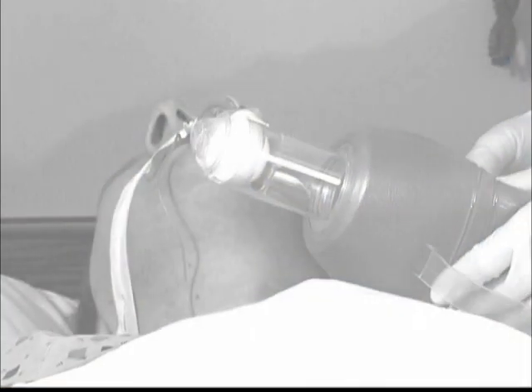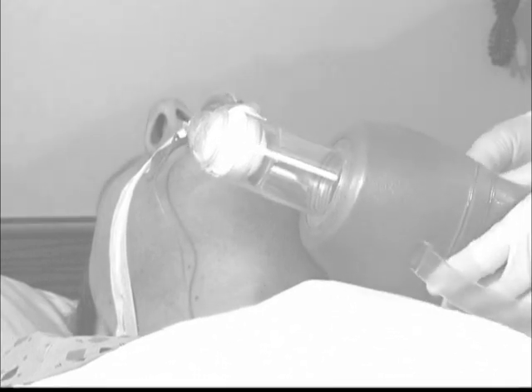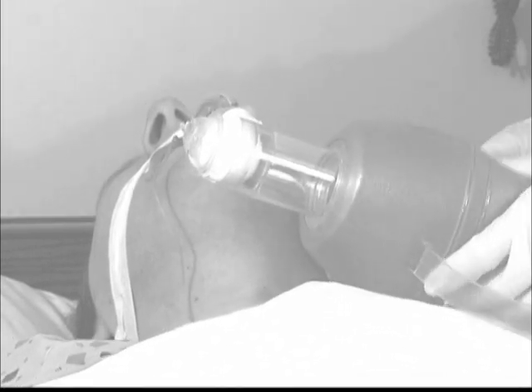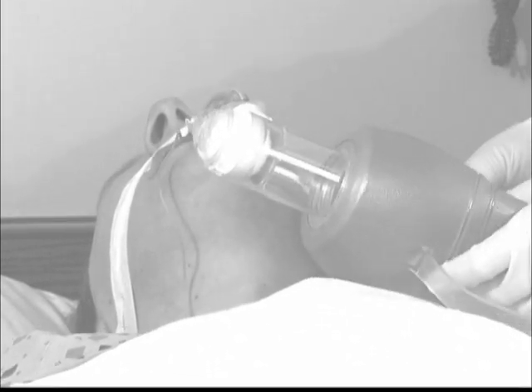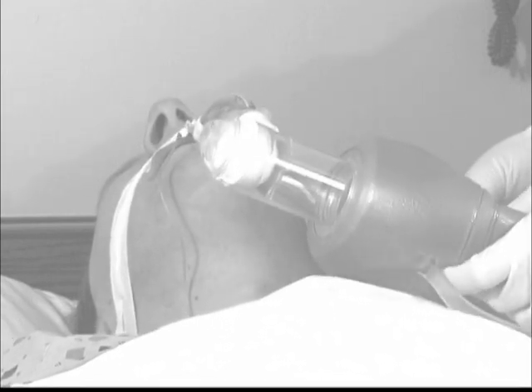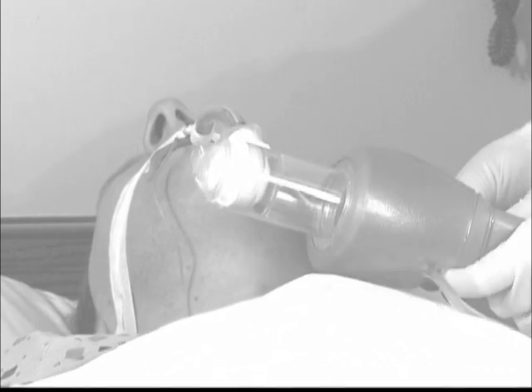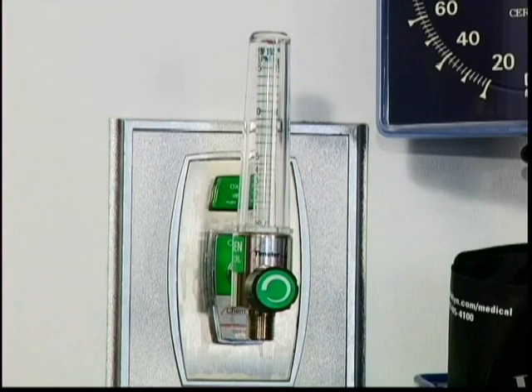In this module, we will be focusing on manual ventilation of adult patients. The function of the bag is dependent on proper assembly and use of adequate flow of oxygen. Most bags come from the manufacturer preassembled, but assembly requirements will vary by manufacturer. Frequently, however, the practitioner only needs to attach oxygen tubing to an oxygen flow meter.